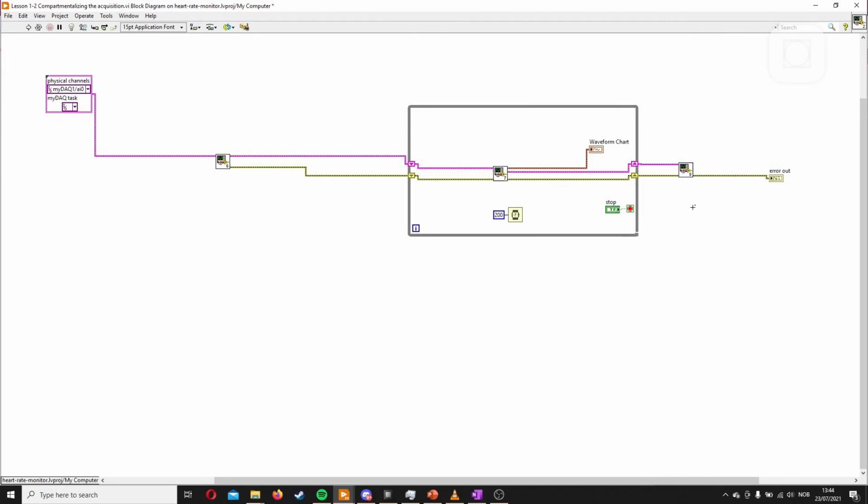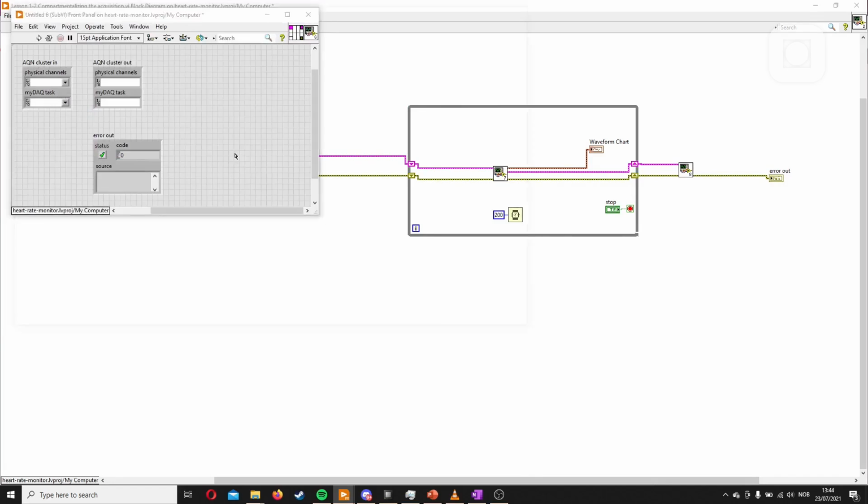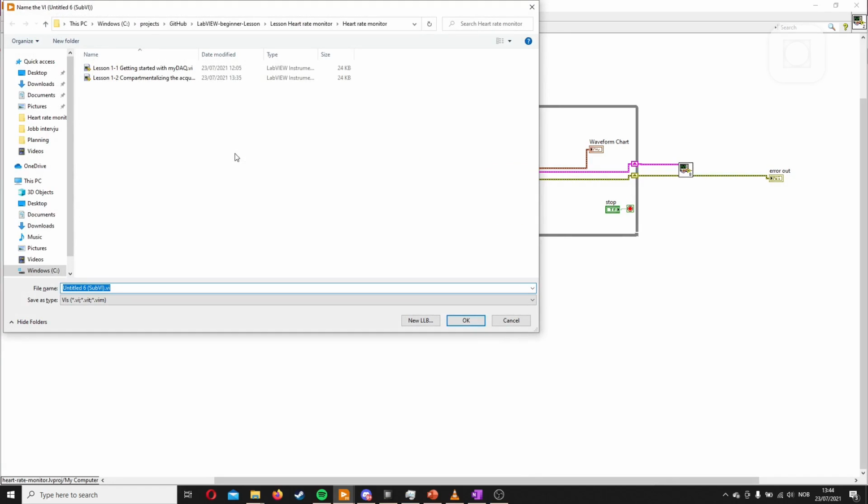Now we need to save them and label them properly. So first we'll go to this. We'll save it as heart rate monitor dash acquisition dash init. Or we can call it myDAQ init. So this we know initiates the myDAQ.